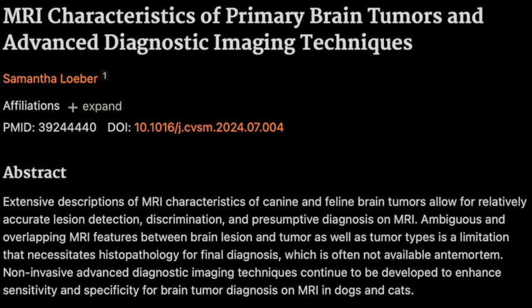In a way, yes. And finally, perfusion-weighted imaging. That one looks at blood flow. How much blood is going to the tumor, how fast it's moving. This tells us about the tumor's vascularity, how many blood vessels it has. And why is that important? Well, highly vascular tumors tend to grow faster, and they can be more difficult to treat. So it's like a traffic report for blood cells in the tumor.